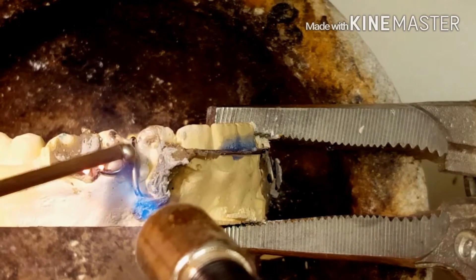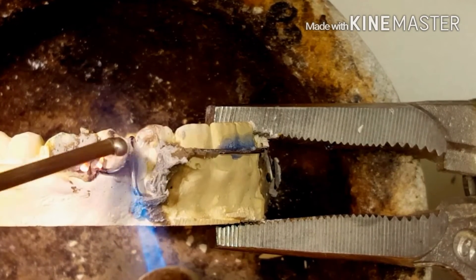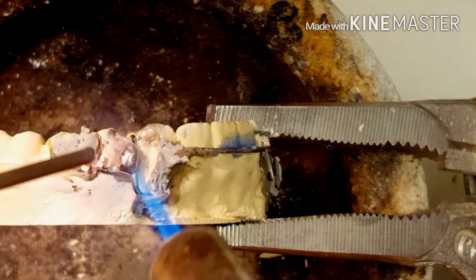I personally like a thicker solder because I just feel like the solder joint goes faster. Some people use really thin solder, but I prefer thicker.